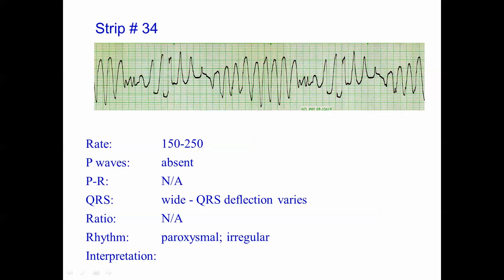The ratio is not applicable because we don't have P waves. The rhythm is irregularly irregular and tends to happen in paroxysms. Patients may experience paroxysmal bouts of torsade de pointes that may last 15 to 20 seconds in length and may have seemingly benign signs and symptoms, or they may have a sustained torsade de pointes.